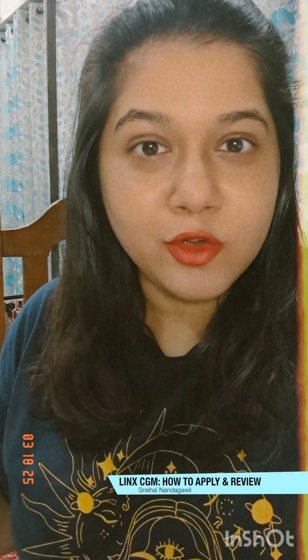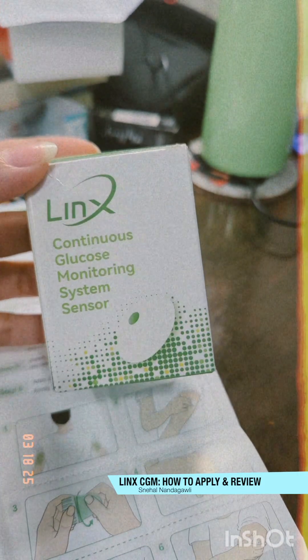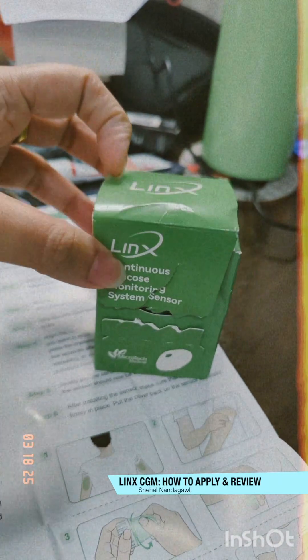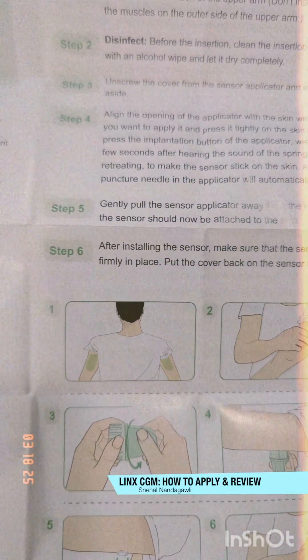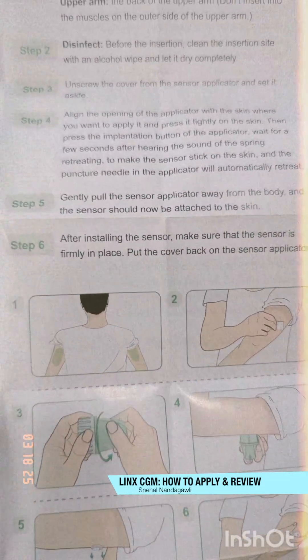I'm trying the new CGM which is the Linx, and I want to show you the process and how I'm doing it. This is the first time I'm applying it myself, so bear with me. It comes in a box like this — it looks very tiny, so I was a little surprised by the size. This is how the box looks inside, and it also comes with a pamphlet which gives you the instructions for how to apply it.